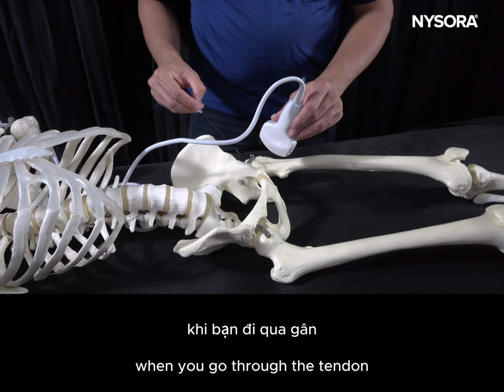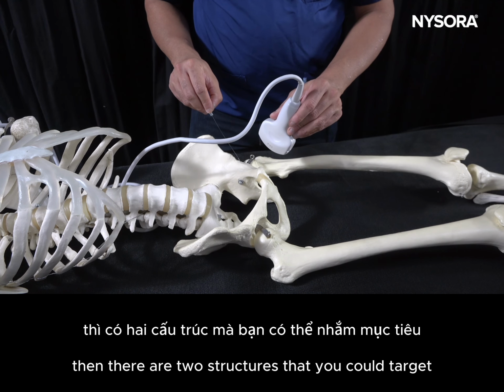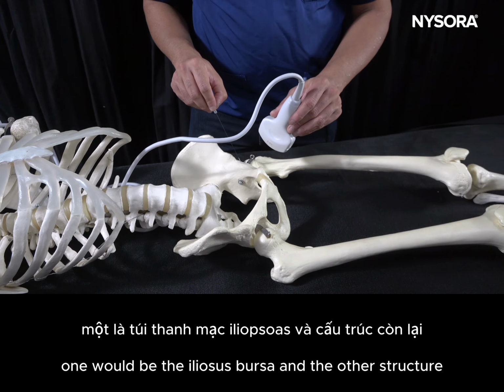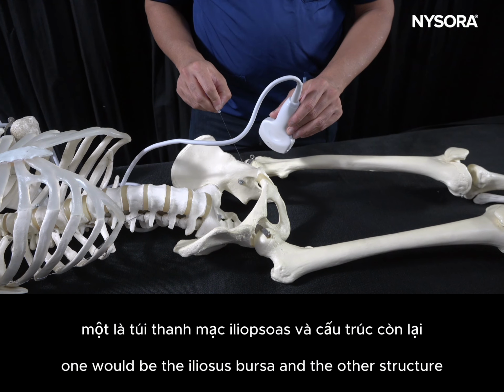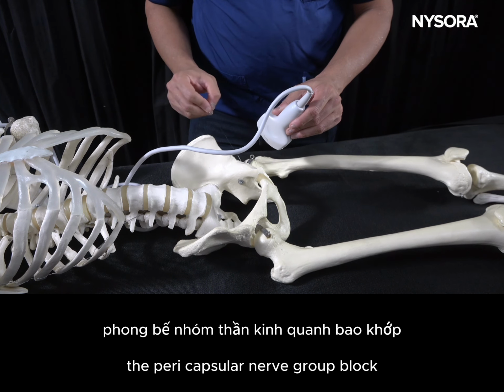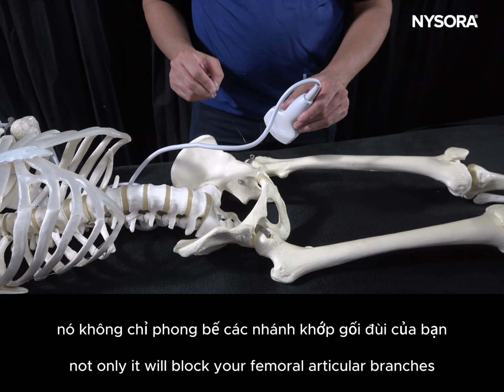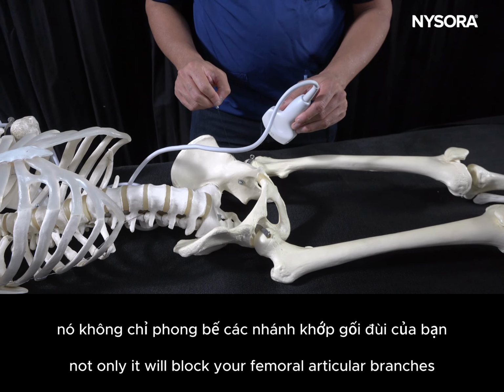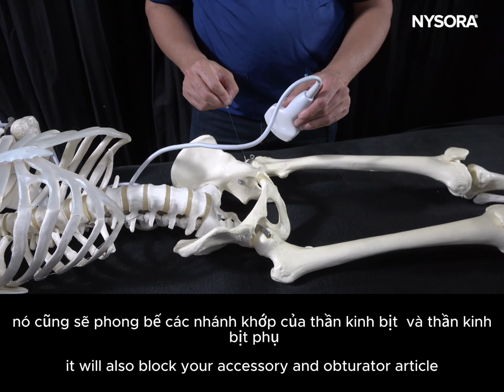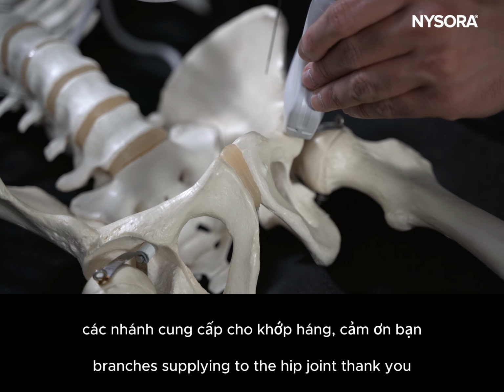When you go through the tendon, and your needle is located below the tendon, there are two structures that you could target. One would be the iliopsoas bursa, and the other would be the PENG block, the pericapsular nerve group block, where you inject 15 to 20 mL of local anesthetic. Not only will it block your femoral articular branches, it will also block your accessory obturator and obturator articular branches supplying the hip joint. Thank you.